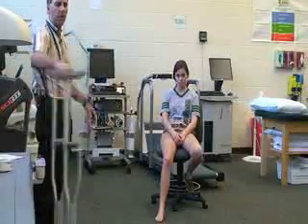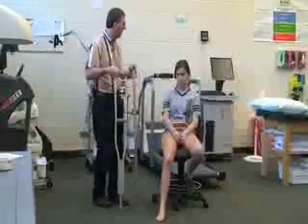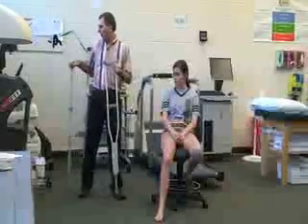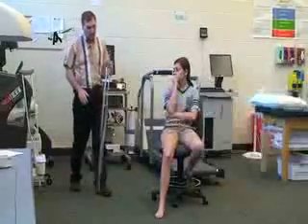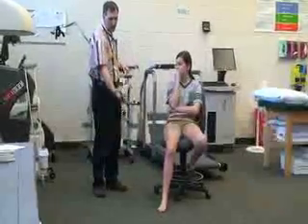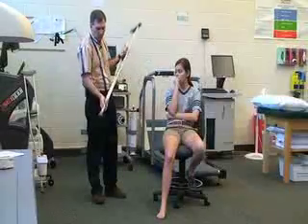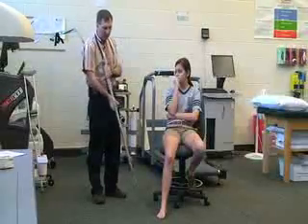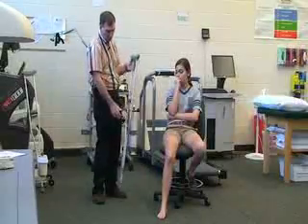The crutches come in different types. We can get wooden crutches or aluminum crutches, and for this one we will use aluminum crutches. You always want to check the crutch to make sure it has adequate pads at the top and the bottom, and inspect them to make sure there are no tears or they're worn. Also check the pads on the hands and make sure the screws are good.